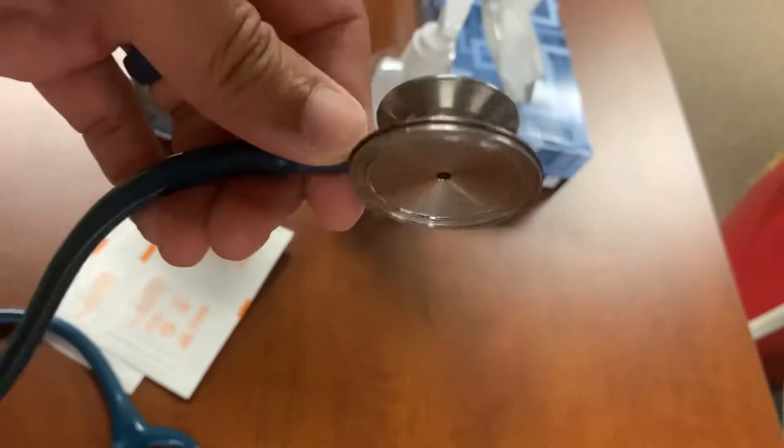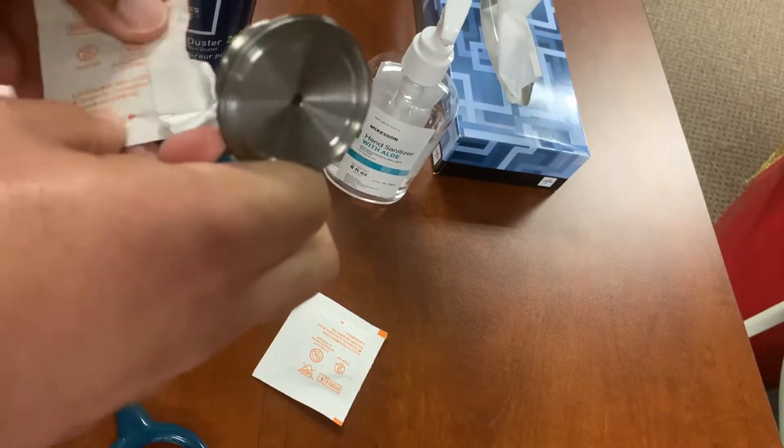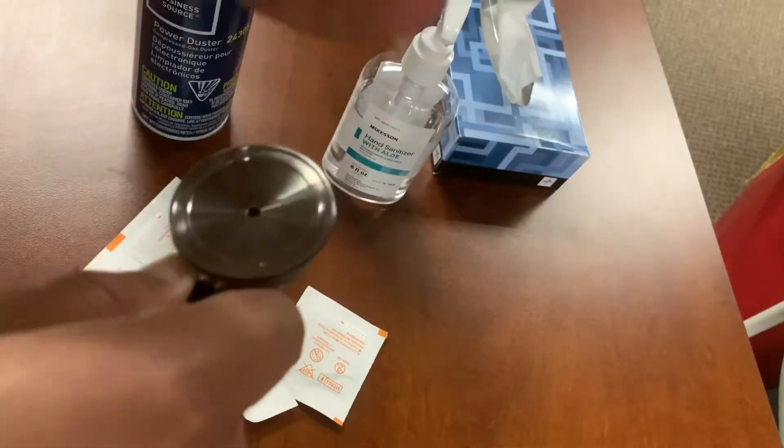Another lesson I learned — these things get freaking gross. The nastiest crap just grows up under it. So it's good to give it a good cleaning with alcohol wipes, sani wipes, or anything. You'll come up with some brown stuff. Mine's pretty clean because I already cleaned it — I just want to show you guys my new discovery.